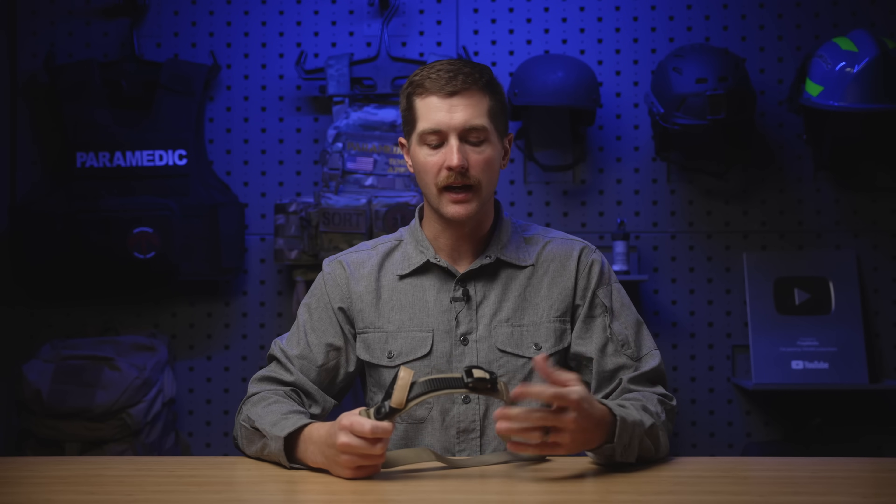Hey guys, my name's Sam and welcome to PrepMedic. Today I'm going to give you a walkthrough of the Ratcheting Medical Tourniquet.